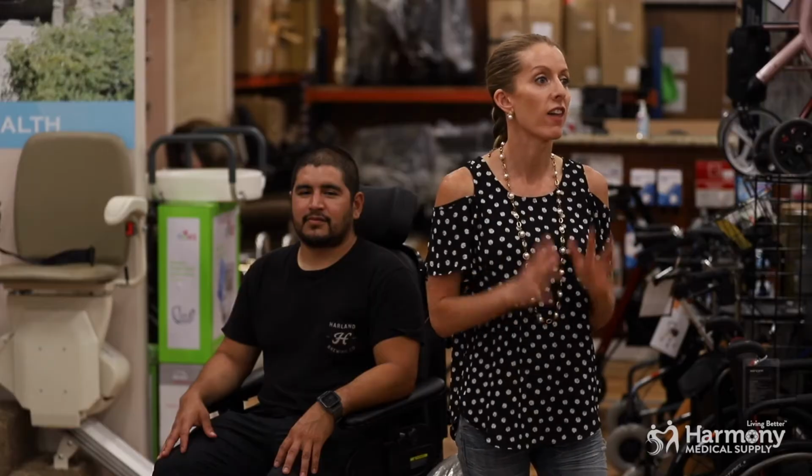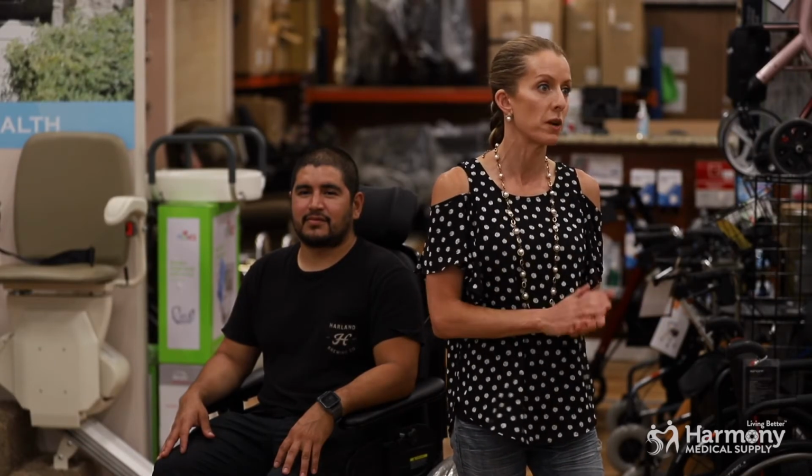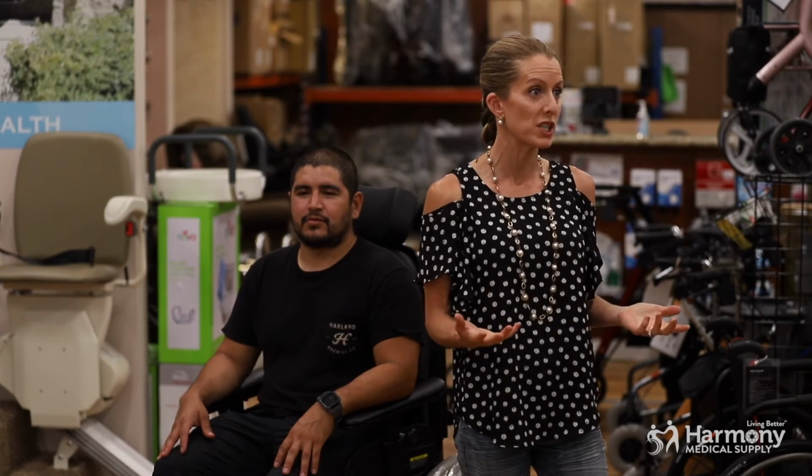Okay, so today we're going to talk about a Tilt-In-Space Recliner. What is a Tilt-In-Space Recliner? A lot of clients don't know. It's often been reserved for people with developmental disabilities or quadriplegics, but I like to use the chair for a lot of different populations, including seniors. So seniors who just have limited mobility and are inclined to get pressure sores.